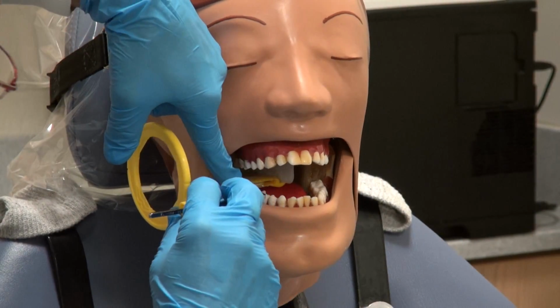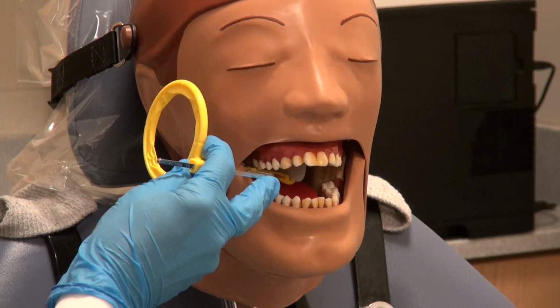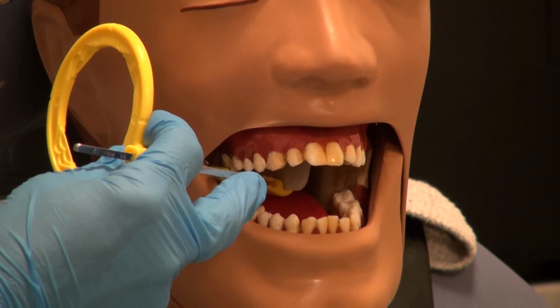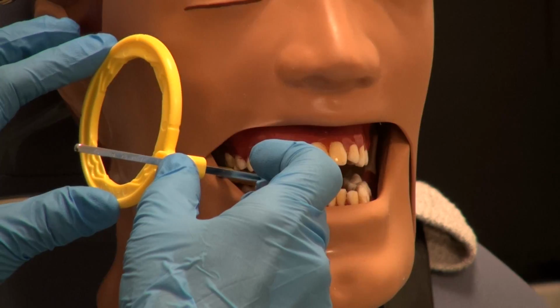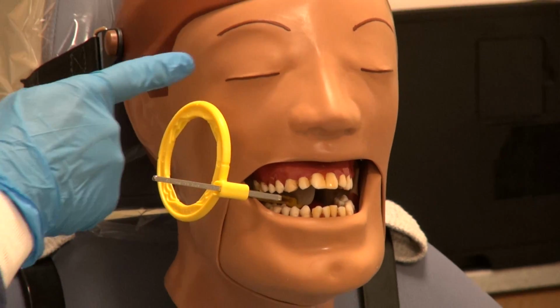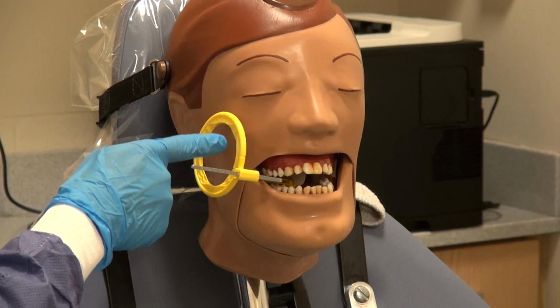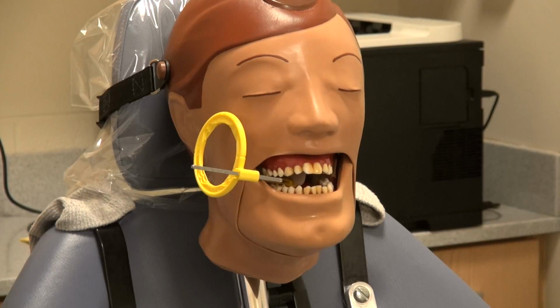In this image, we want to include the distal of the second premolar, the first and second molars, and potentially the third molar, and the maxillary tuberosity. Move the ring close to the face. Check that the film is not bending excessively and that it is parallel to the long axis of the teeth. The central beam should be directed through the contact area between the first and second molars. The point of entry is the line from the outer canthus of the eye, just at the height of the root apices within the center of the ring.